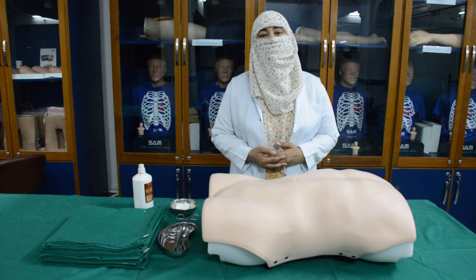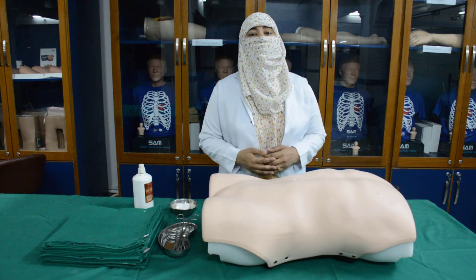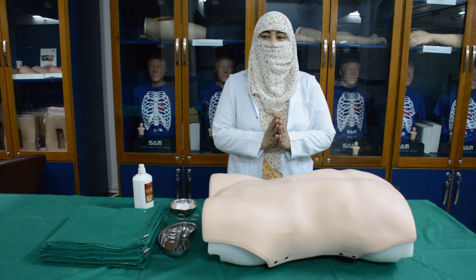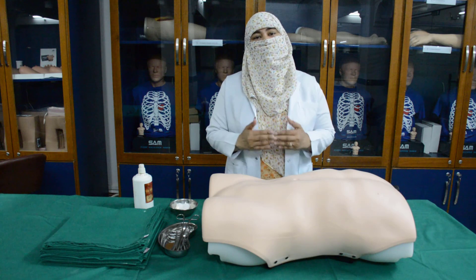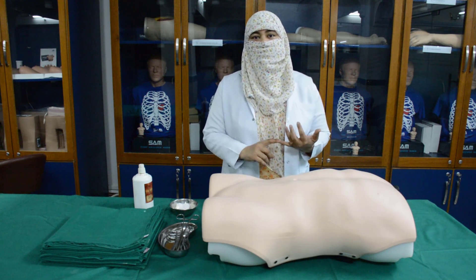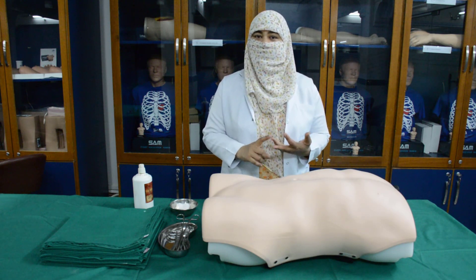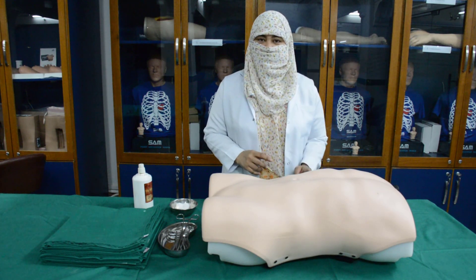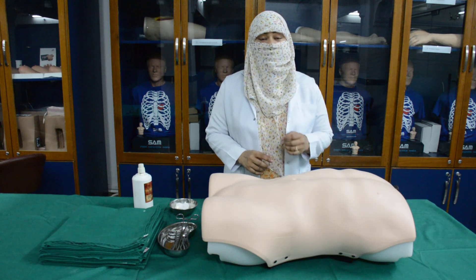Before we start our procedure for draping the patient, you must be scrubbed, gowned, and gloved yourself, and then you can drape the patient.